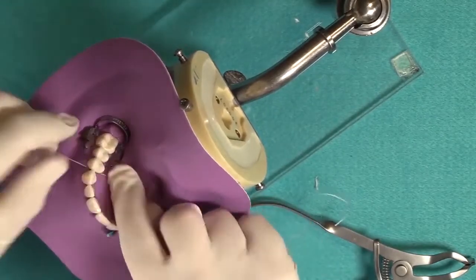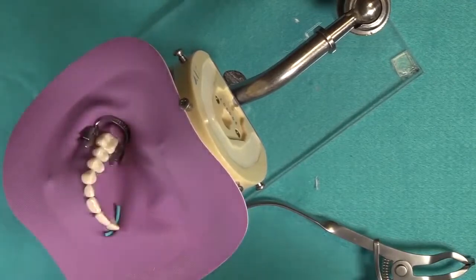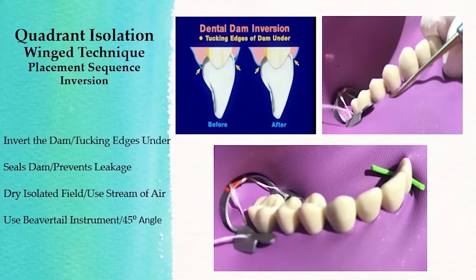By looping it, you're being very efficient because you're not taking a whole lot of floss through the contact. Okay, now the next step is inversion. Now when I'm working by myself, well, first let me talk about if you have some help. You want to make sure that the dam is thoroughly between the contact in order for it to invert. Otherwise, it's not going to invert very well.